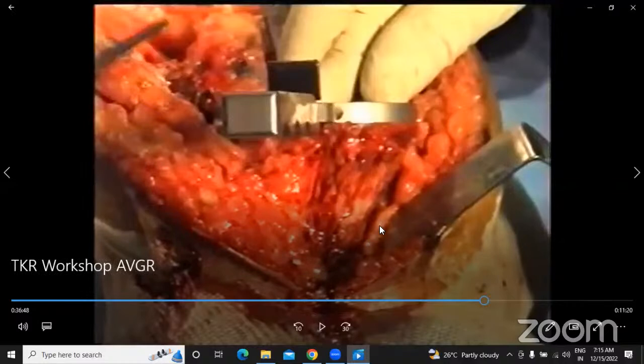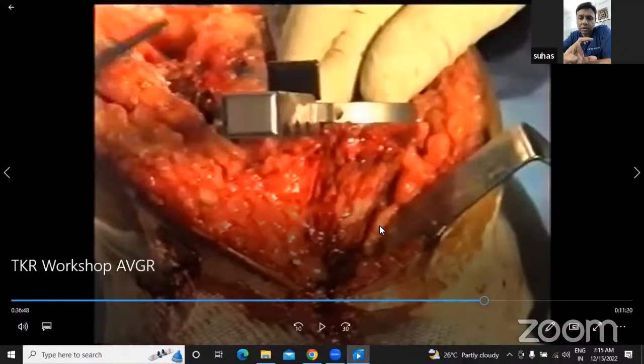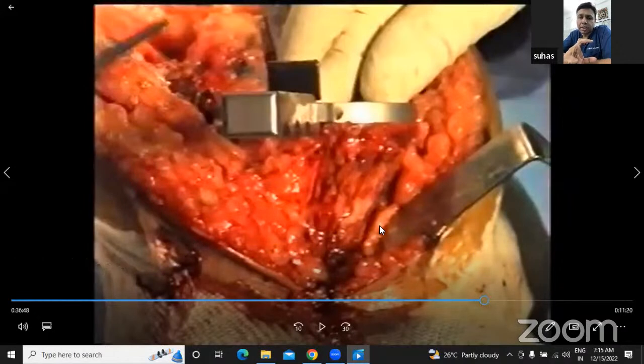And the reason we use lateral is because lateral is constant. There's no expendable bone or anything that's happening. So you size it on the lateral. Medial, if you have more bone or you have to do a reduction osteotomy, you can change sizes. That's why, because the lateral side is constant and it is smaller. So you use that as a reference. And then whatever is going on medially based on the situation of surgery, you decide what needs to be done.